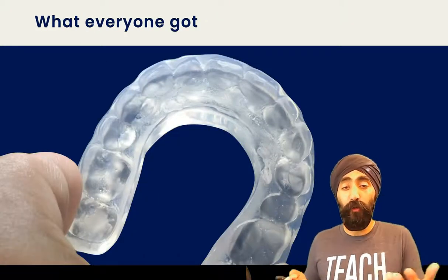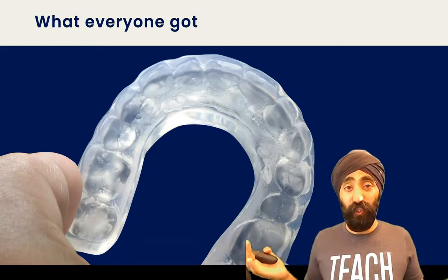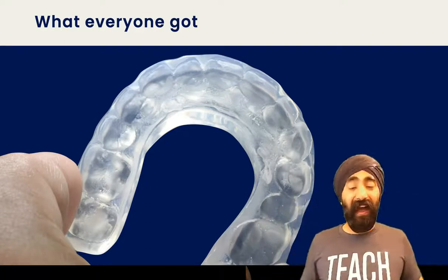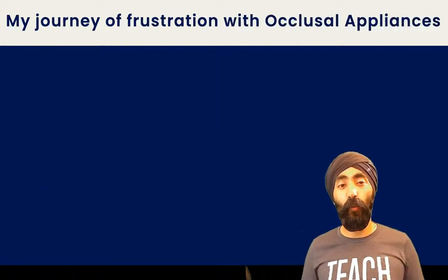So eventually, when I was really confused, like many of you, all of my patients just got a soft splint, right? That's what we just gave to everyone because it's cheap and easy and doesn't take much adjustment or knowledge or skill. And that's what we had, basically. So I'm hoping to open your eyes to other ways.